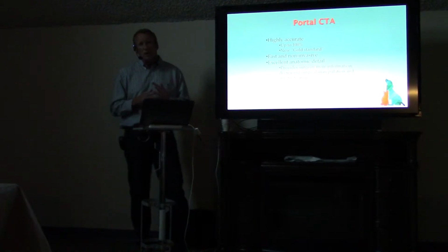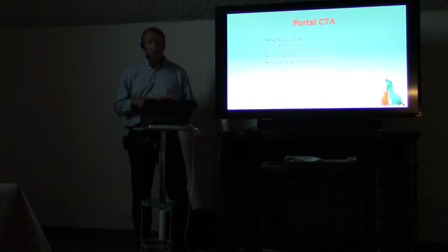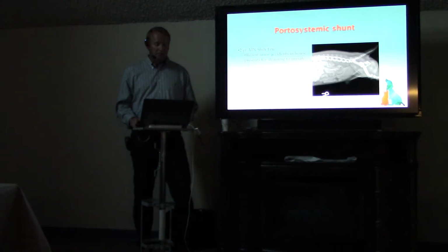The other instance where I might recommend CT is where I can't find a shunt, but I see a lot of other things that make me suspicious of a shunt, and the clinical suspicion is really high for a shunt. It doesn't happen very often, but in those cases, I might recommend a CT exam.